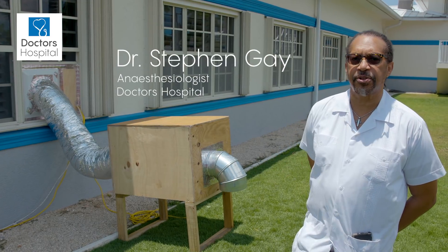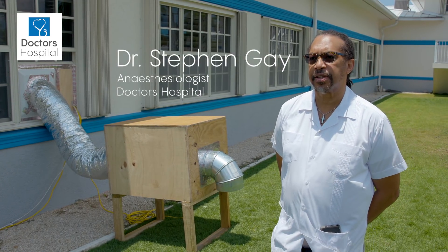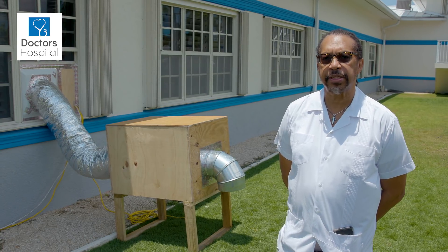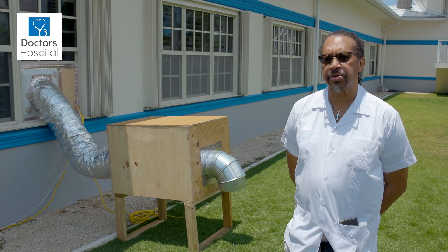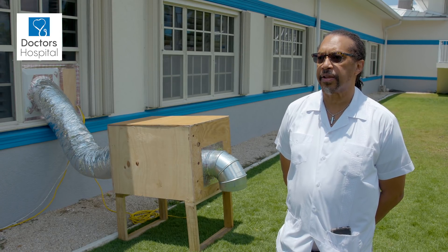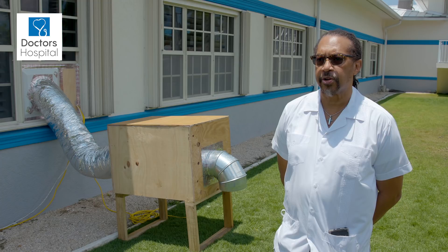This is a device to create negative pressure in the negative pressure rooms that we have created in the hospital. These rooms will be used to manage patients whose COVID status is unknown, or patients who are COVID positive.